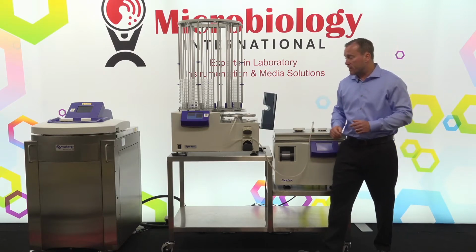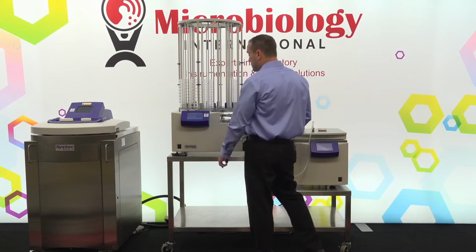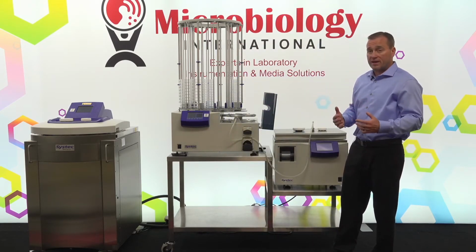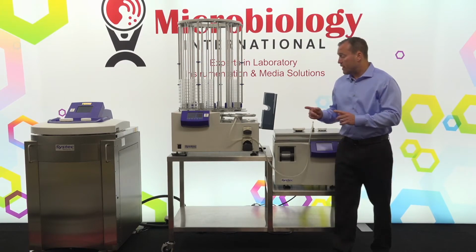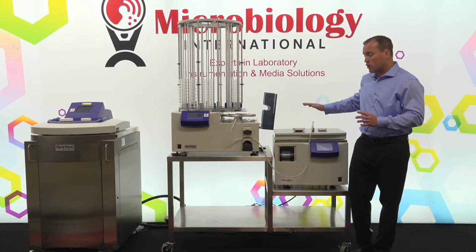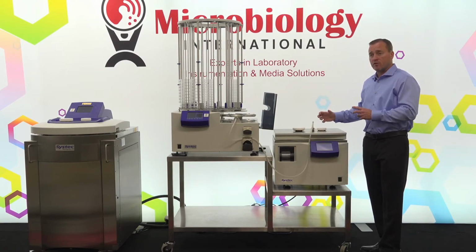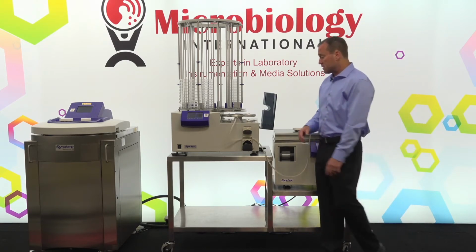So once that's finished, we can just hit exit process if we want to. It stops, and now we can either move on to the next process or go through any type of cleaning for the instrument. So what I'm going to do now is take the system apart and go through what the cleaning would look like. You saw the bucket removed from this instrument. Once that inner vessel is removed, you simply take it to a sink and wash it, and then you're ready to move on to the next cycle.